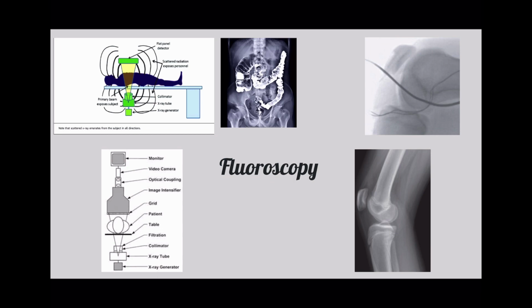Radiation safety training is an important component of medical education, especially to us future imaging technicians and radiologists. If we go back to the image on the upper left corner, we can see the way in which rays are scattered when doing fluoroscopic exams and evaluation on patients.